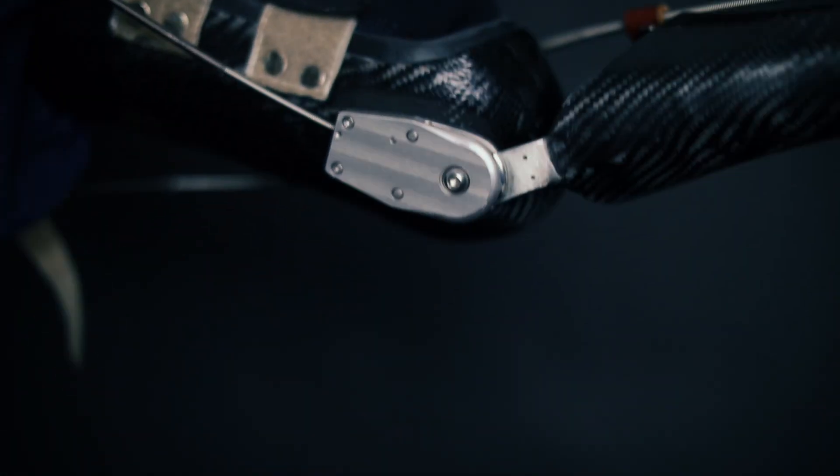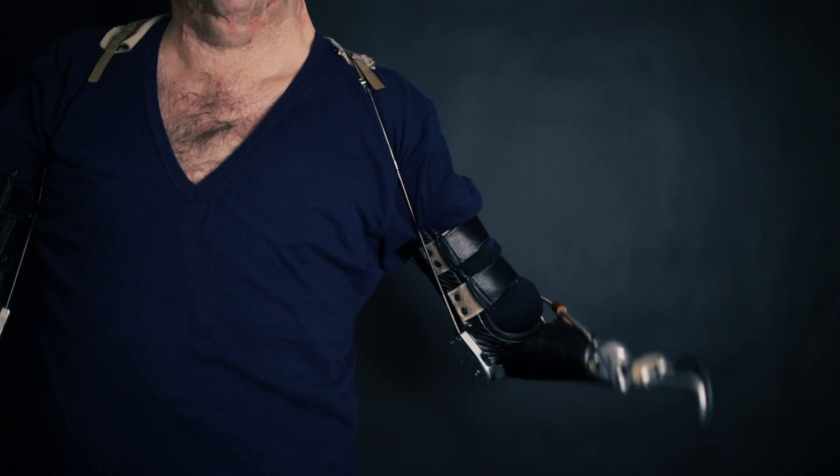I can pull the cable by extending my arm downwards. This disengages the locking mechanism from the internal cog, allowing me to reposition the elbow, then releasing the cable to lock the mechanism into place. Simple.